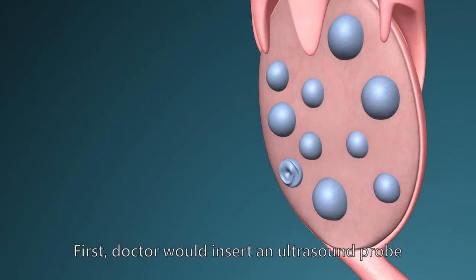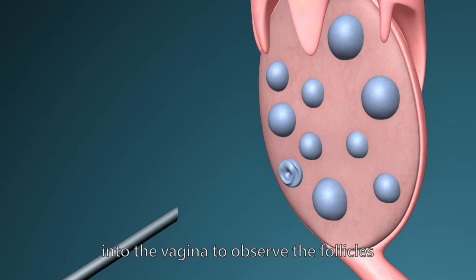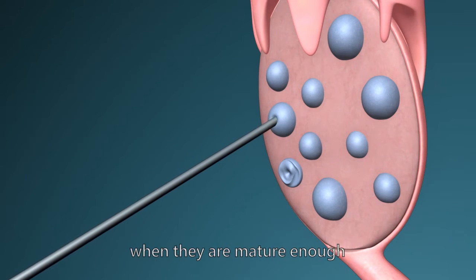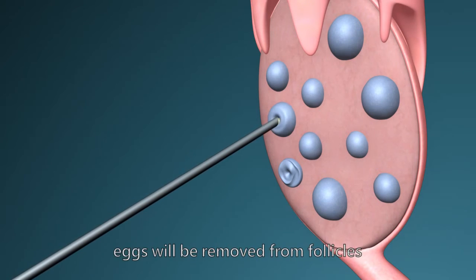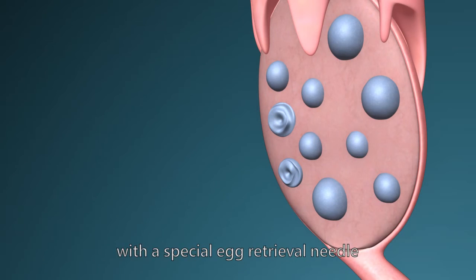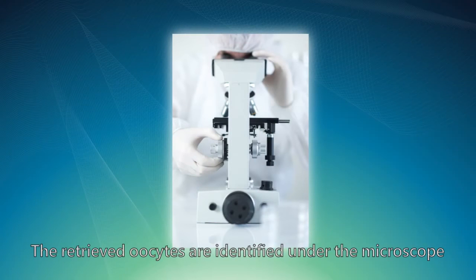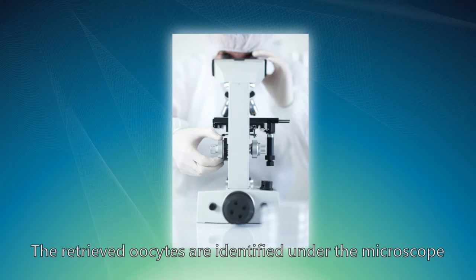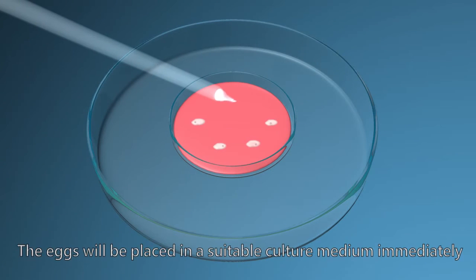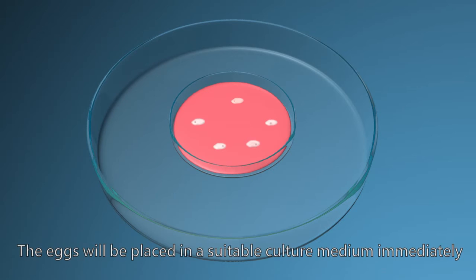First, doctors would insert an ultrasound probe into the vagina to observe the follicles. When they are mature enough, eggs will be removed with a special egg retrieval needle. The retrieved oocytes are identified under the microscope, and the eggs will be placed in a suitable culture medium immediately.